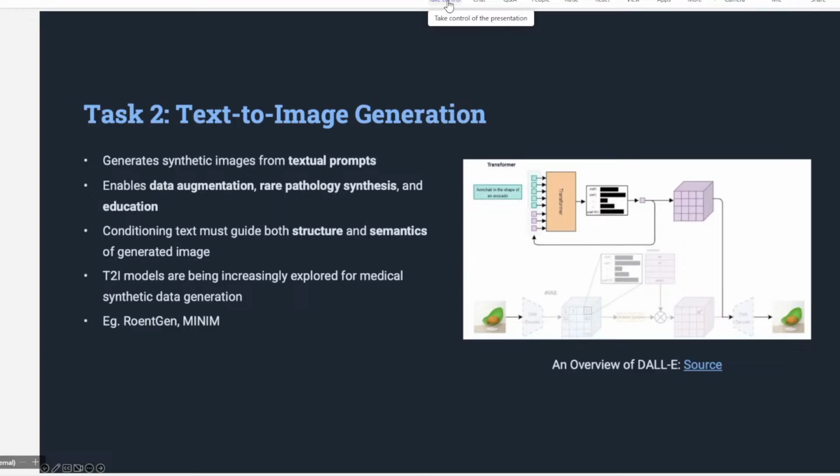And then inference is what is shown in the upper part of the image. All you need during inference is a text prompt. And they use a pre-trained transformer here, which already knows how to convert text into meaningful tokens. So if you see here, the text is already processed into a latent space, and then you just pass those embeddings directly to the discrete variational autoencoder, but just the decoder part, because the latent embeddings have already been computed.